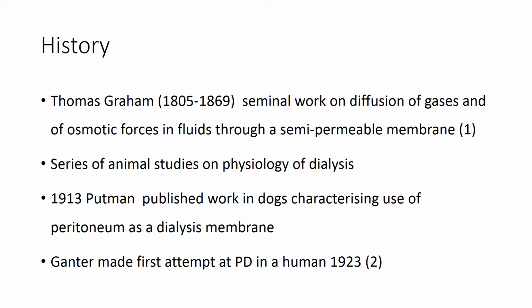I think it was in the 60s, and then from then on to where we are now, where we actually have commercially available fluids and we have specific catheters for use, and to a position where peritoneal dialysis is the preferred treatment in children, and definitely from an economic point of view is the most available dialysis treatment for children in low resource settings such as ours.